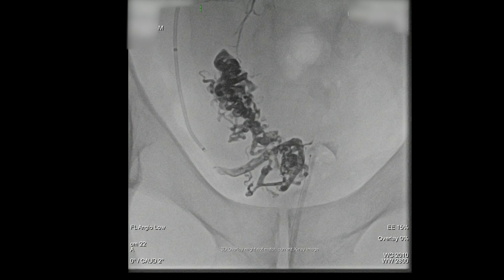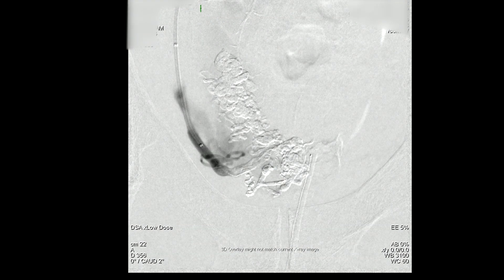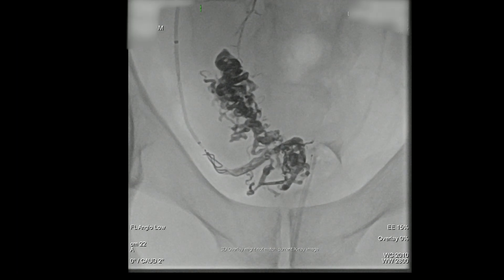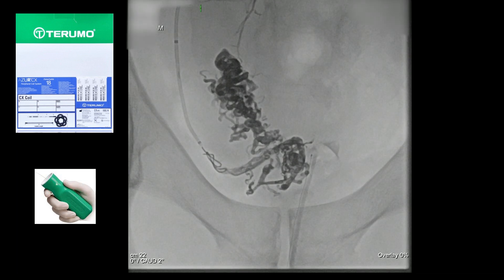The microcatheter's out. Let's check it — looks really good. You can still see that big venous sign here as it's filling in the background, but a lot less obvious. Typically we use Terumo coils — they are detachable coils, easily positionable, and if you don't like them, you can retrieve them.